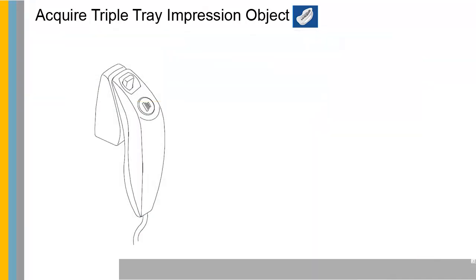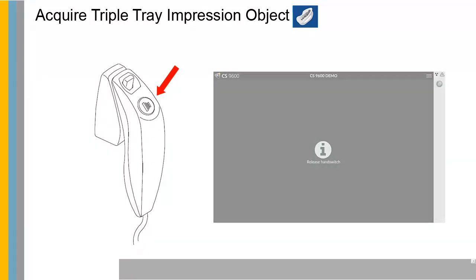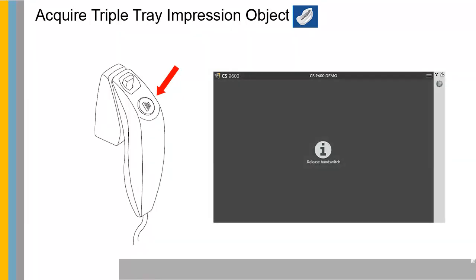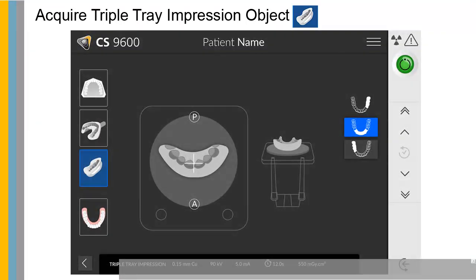Launch the X-ray with the remote control. Press and hold the exposure button until the end of the acquisition is indicated by the on-screen release switch message. When the acquisition ends, the acquired image appears on your screen. Repeat this process for each object.